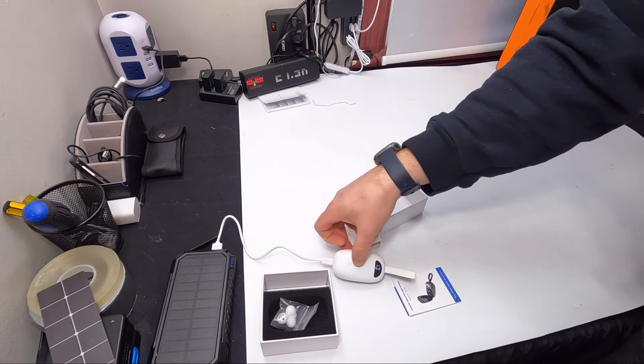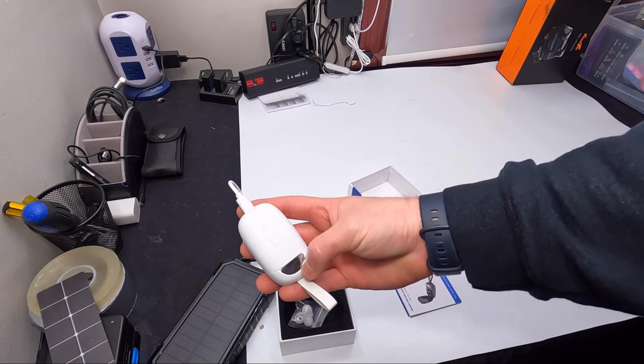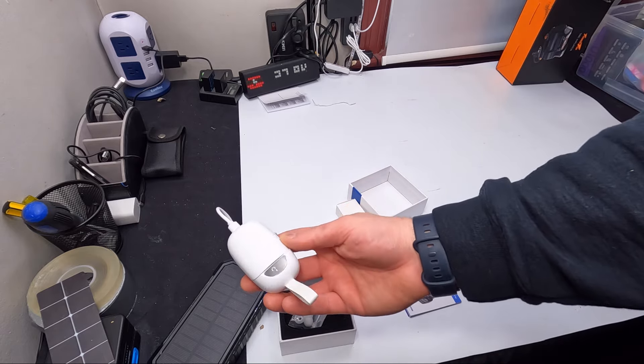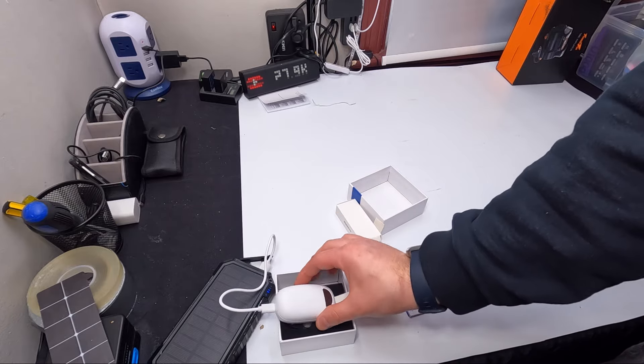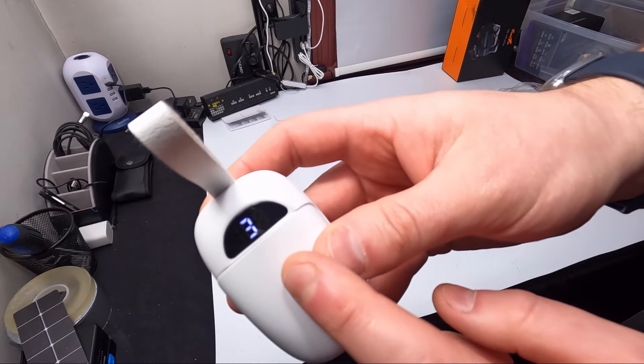As you plug it in you can see it's at zero, so there's no power in the box right now. We're going to let this charge, put them in, and test them out. Alright guys, we're back — we had it charging and as you can see it is at 32 percent.